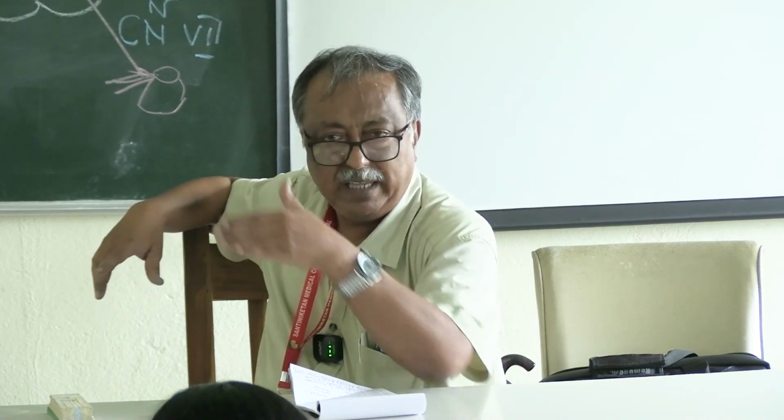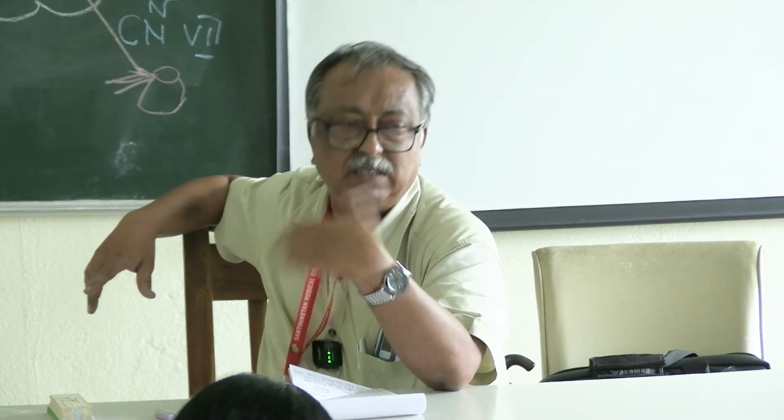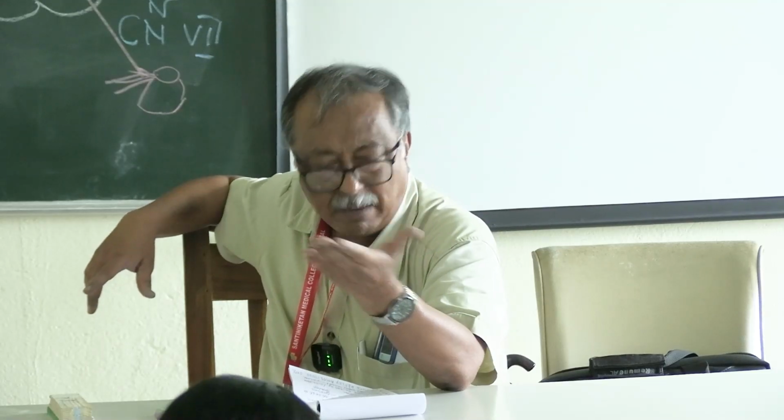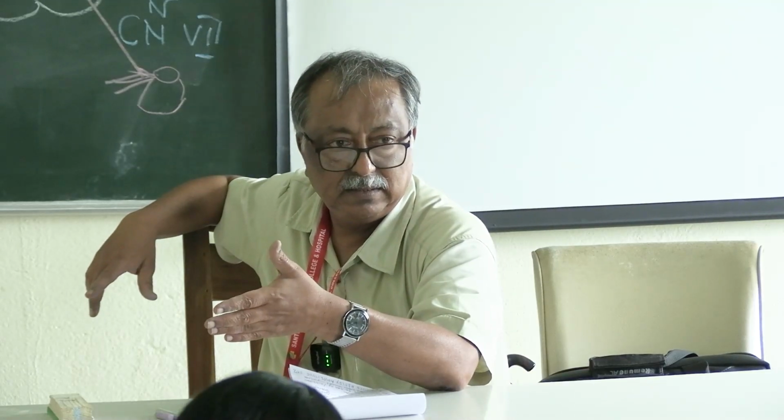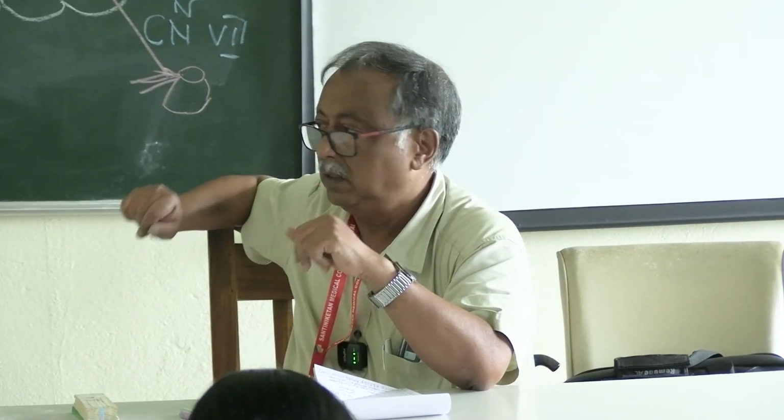If during operation I cut or damage the facial nerve proximal to the emerging site of the nerve to the stapedius, then we will not get any stapedial reflex.